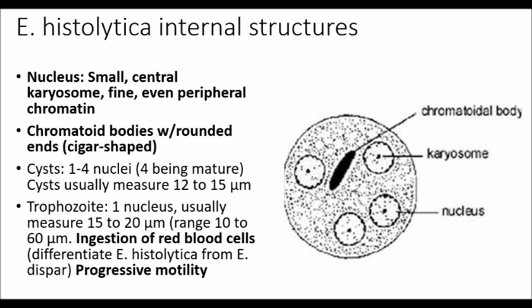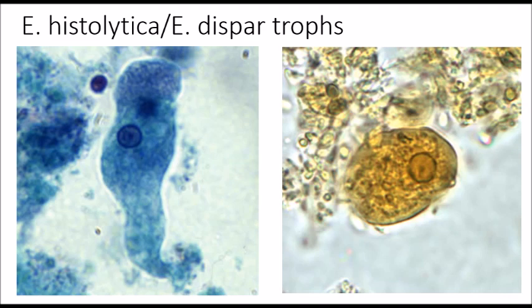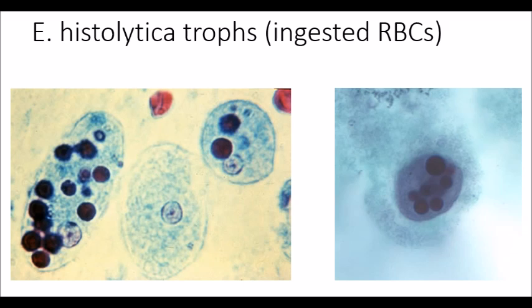The trophozoites of E. histolytica have a progressive motility. In these pictures you can see E. histolytica and E. dispar cysts, with arrows pointing at the nuclei and chromatoid bars — but based on morphology alone you cannot differentiate the two. Here we have the E. histolytica and E. dispar trophs, again with a single nucleus — and again you cannot differentiate between the two species. However, when you see the ingested RBCs within these trophozoites, you can identify this as Entamoeba histolytica.